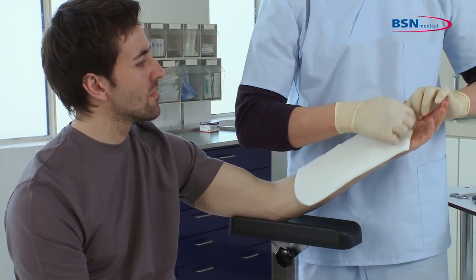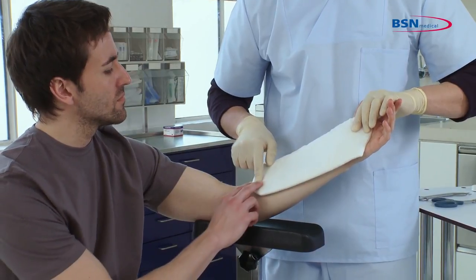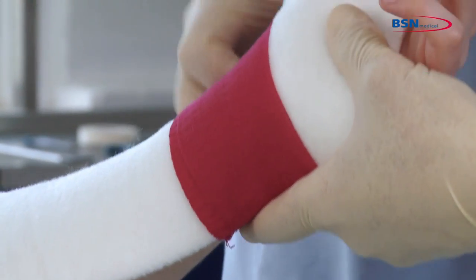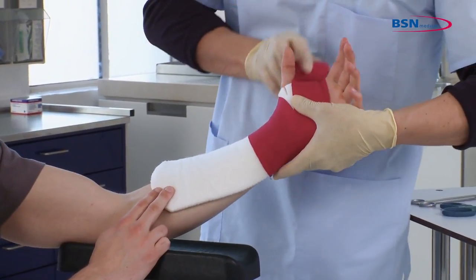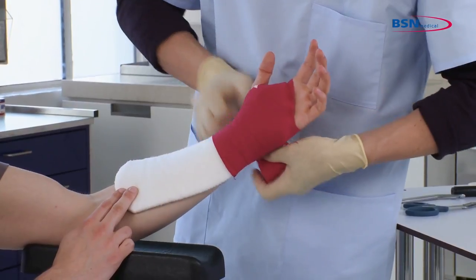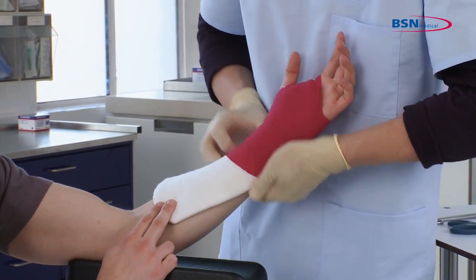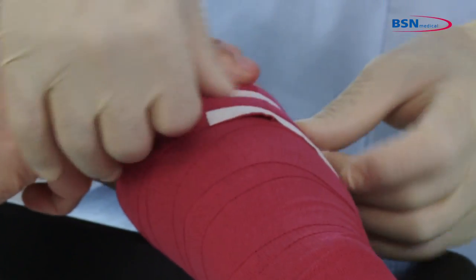Apply the splint on the patient's arm by positioning it towards the palmar crease. To secure the splint, wrap with a bandage distal to proximal. Anchor at the wrist and twice through the web space and around the thumb. Proceed up the arm with overlapping by 50% of the bandage and fixate the bandage with tape or a hook and loop fastener.